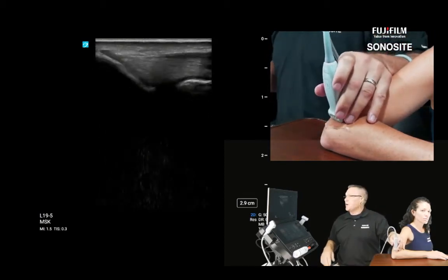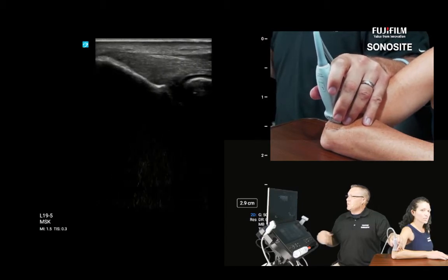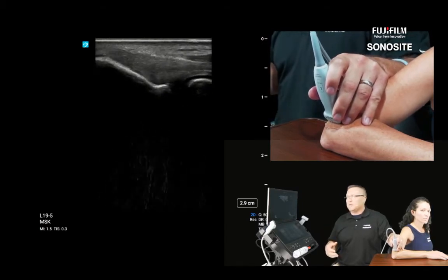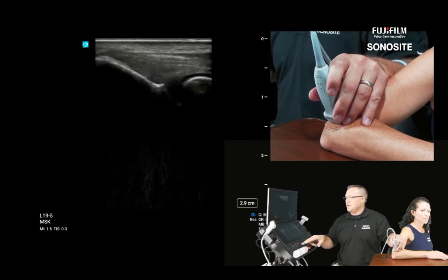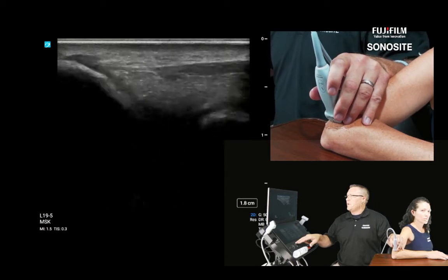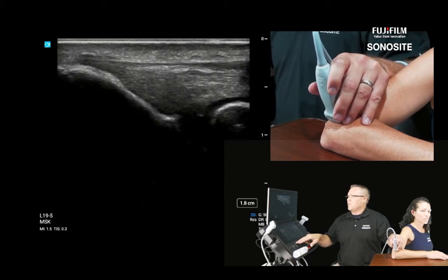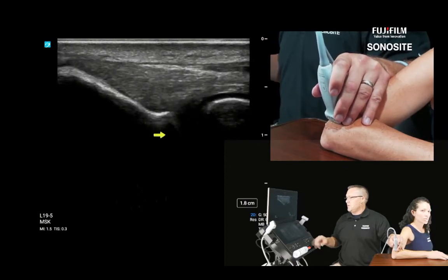Not saying this completely takes the place of an MRI, but it does a pretty good job. So on the left side of the screen, actually when we switch to the L19 from a perspective standpoint, it starts at a much deeper depth than is necessary. That's because at 19 megahertz, things are very much blown up on the screen. I'm just going to bring our depth up more shallow here. That way we can kind of take advantage of the full screen effect here. Get my arrow back up there.